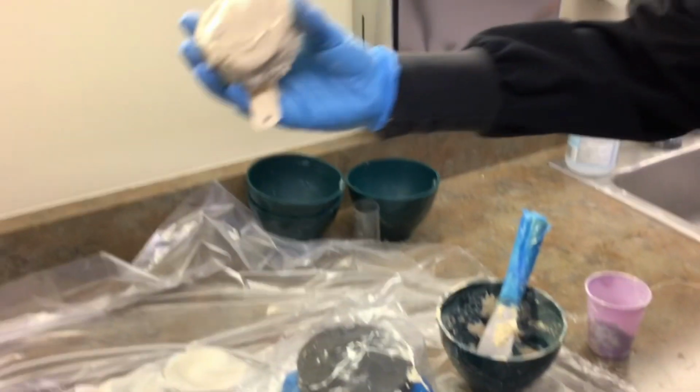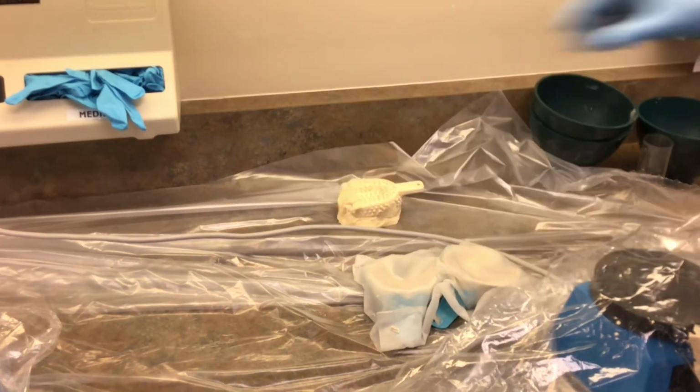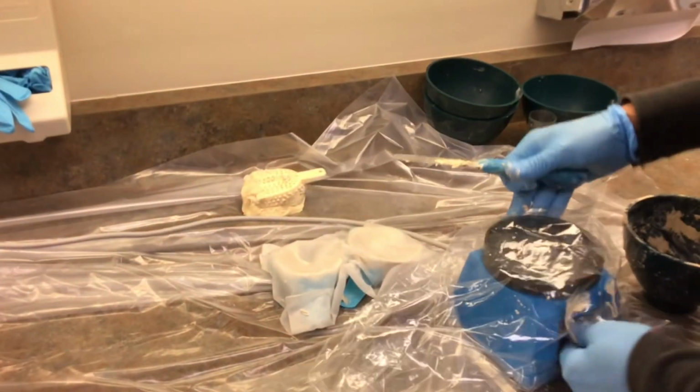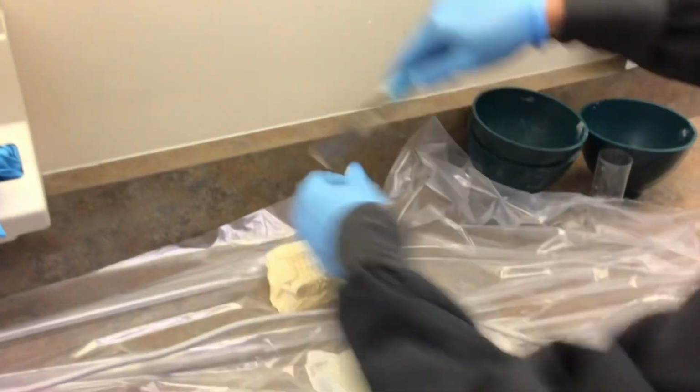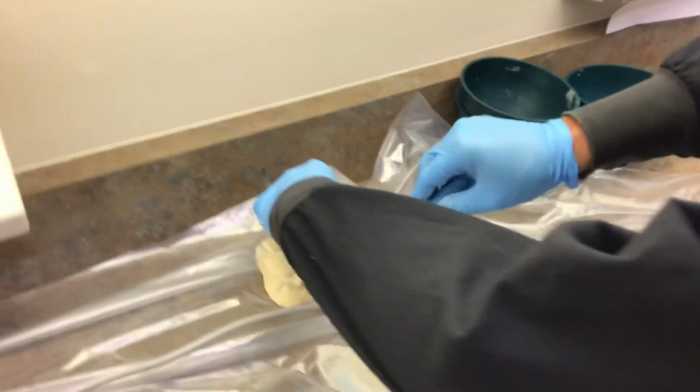And then I do the invert, which I'll invert it over. Go around the edges. Make sure it doesn't interlock. And you're good.